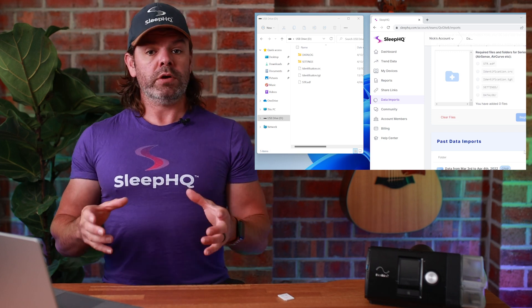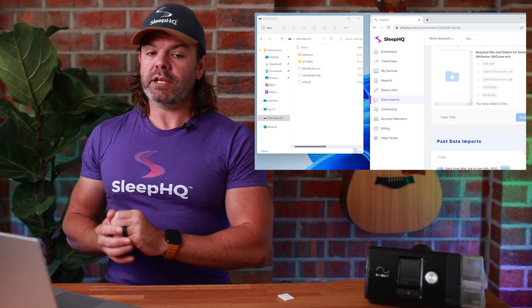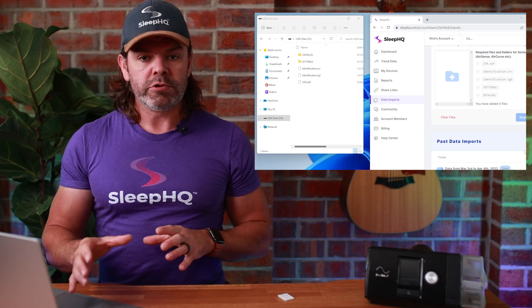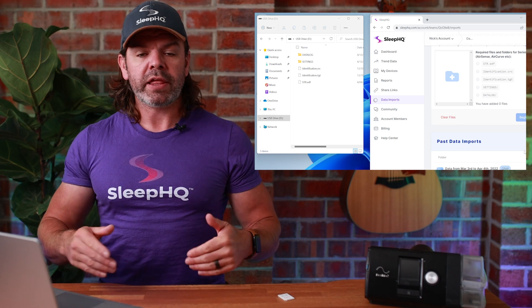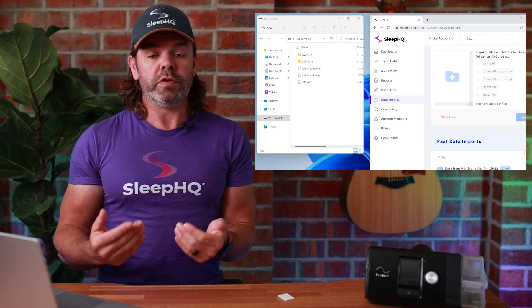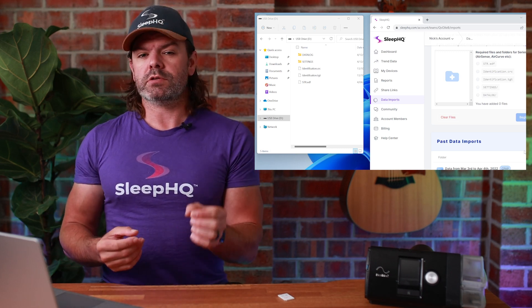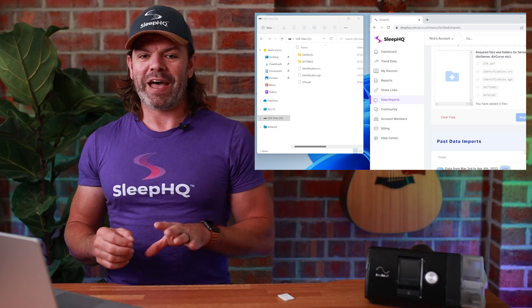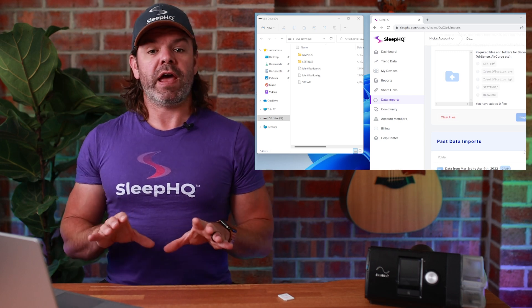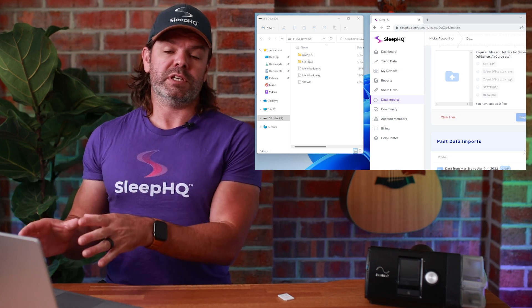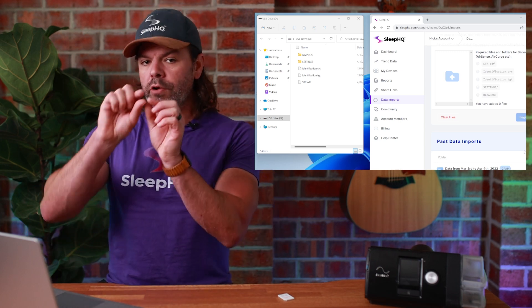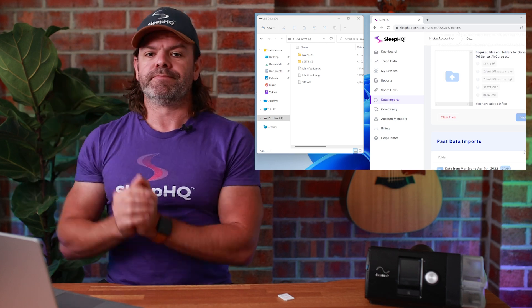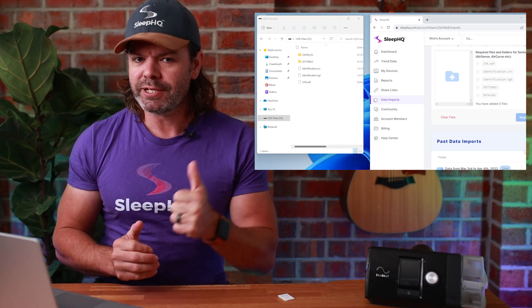Once the upload is complete, SleepHQ will start processing the files and compiling all the charts and information for you to view. So as soon as that upload's complete, yes, you can start going around and looking around the app, navigating away from this main page. But while that upload is going, just make sure you stay on the page.